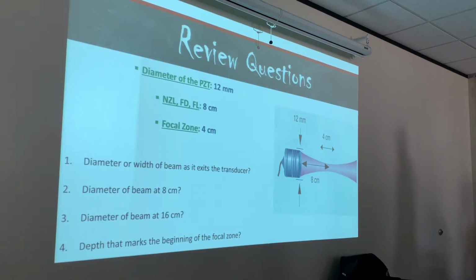So what's the 12 millimeter? That's describing the diameter of the PZT, in millimeters, right here. It's an illustration, so of course it's not going to be accurate numbers. All right, so question number 1, guys.